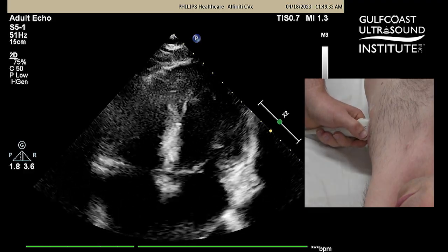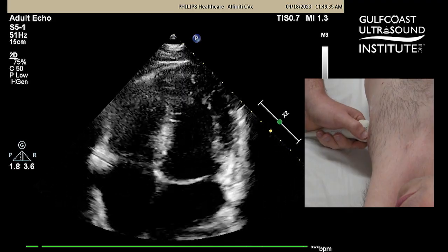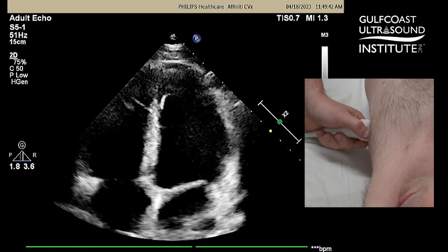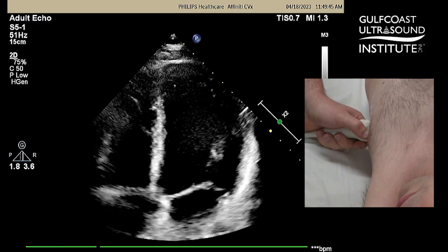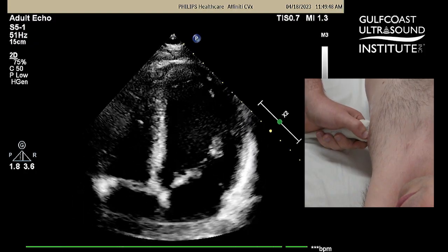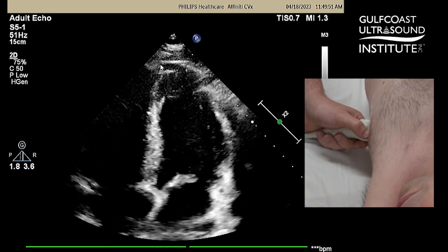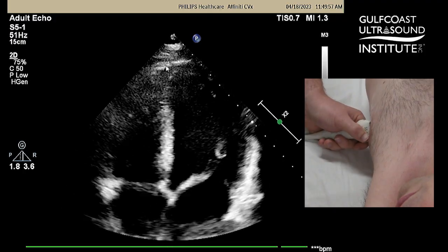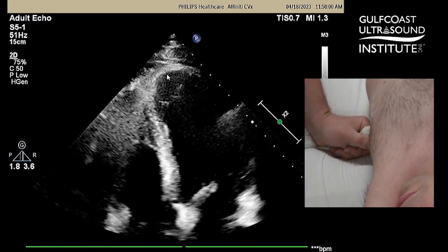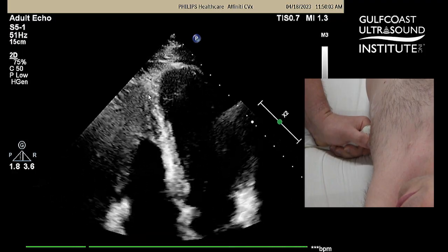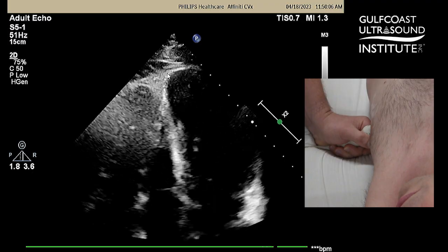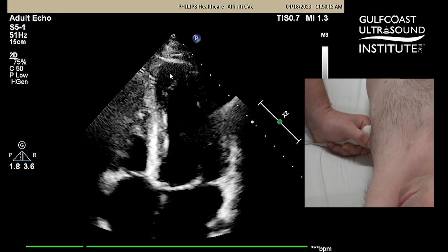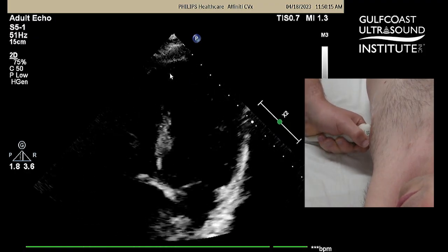Before we get into our apical sweep, I want to briefly touch on the importance of on-axis versus off-axis imaging in the apical views. Here we can notice that I am off-axis — it appears like the apex is thickening, and I can also see that the RV apex is at the same level as the LV apex, so we are missing the true apex. Going a little more lateral, we can now see that the RV apex insertion is lower on our screen than the LV apex, which is definitely important to truly see apical anatomy.